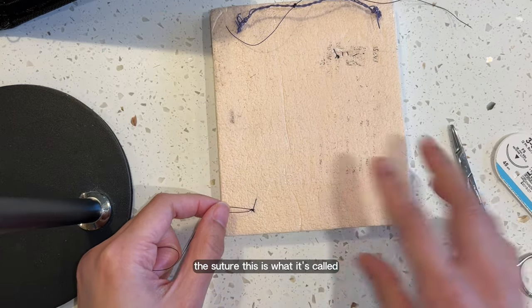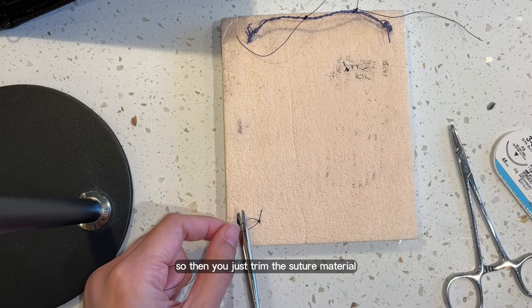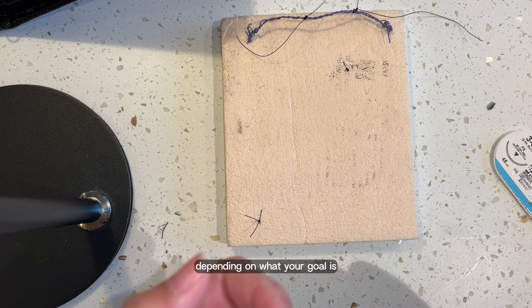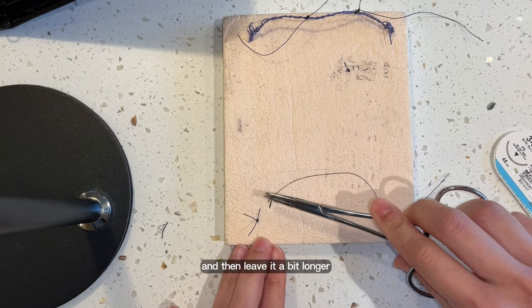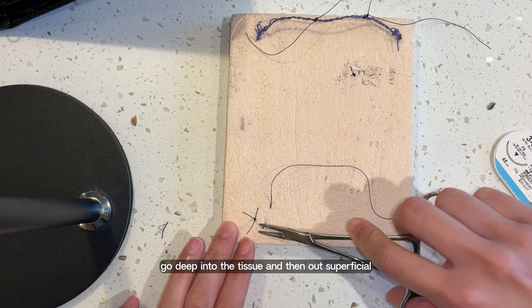It's a simple interrupted suture — this is what it's called — which means there's only one suture. So you can just trim the suture material. I like to leave the ears a little bit long, depending on what your goal is. If it's to be removed at a post-op appointment, leave it a bit longer. Now we'll do surgeon's knot — same again: go deep into the tissue and then out superficial.